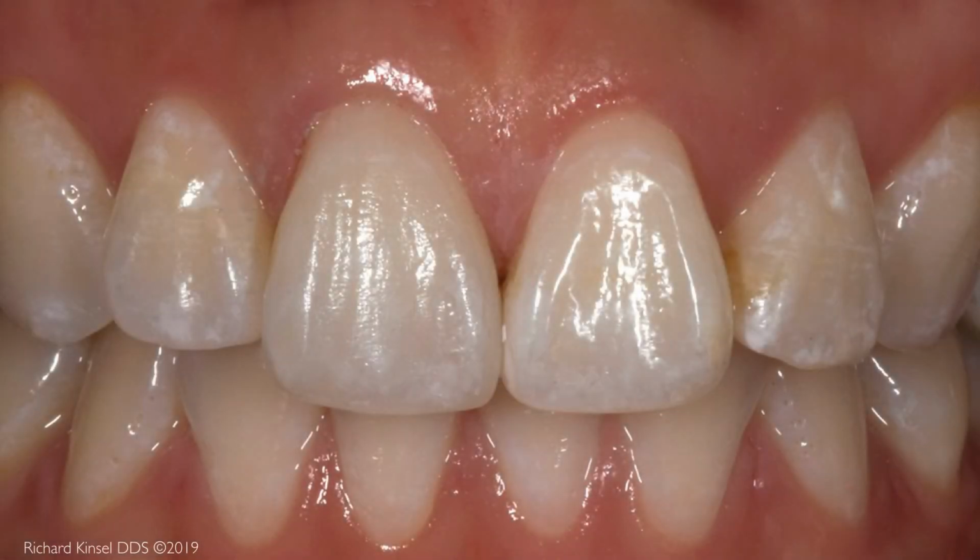Sometimes a porcelain veneer can be bonded to teeth without the removal of any enamel. The patient shown here has a deficiency in length and prominence of the central incisor on the left. This is the porcelain veneer that has been bonded onto the natural tooth enamel.